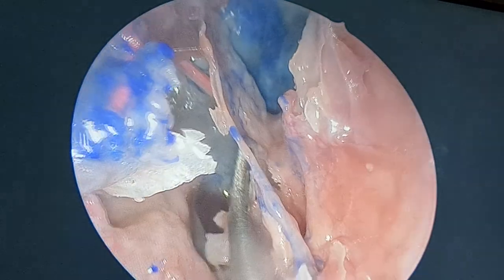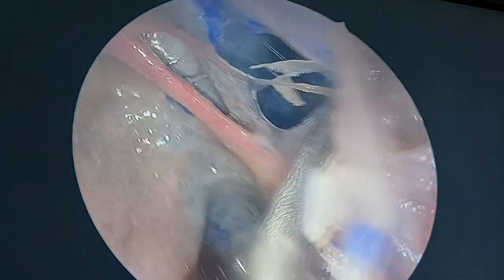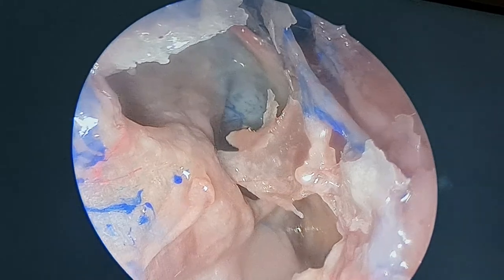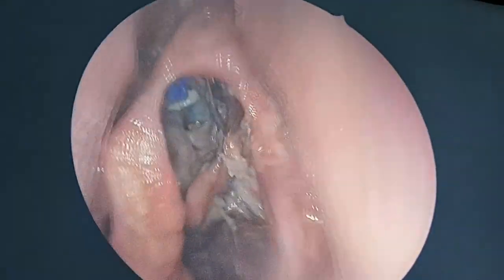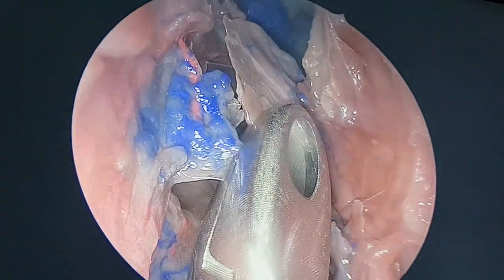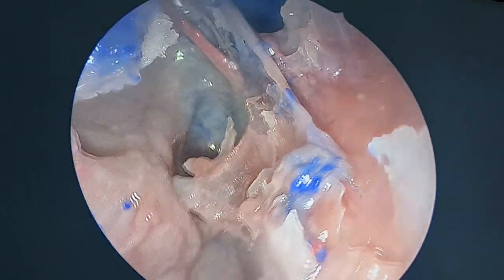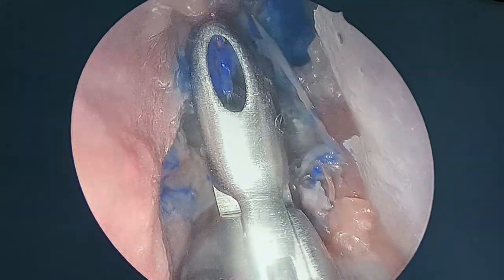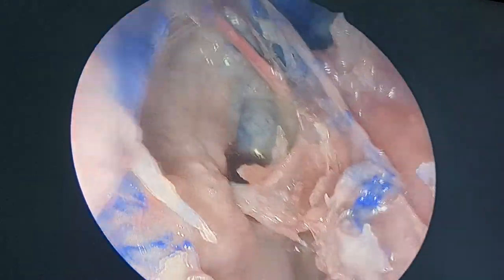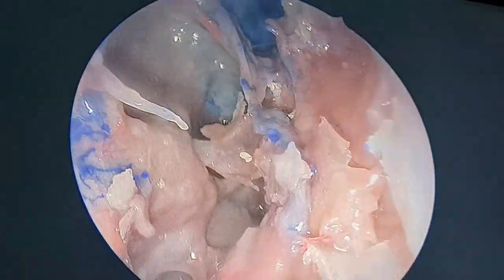This is going anterior, covering the anterior ethmoidal artery. Can you see here? Yes, and see the anterior ethmoidal artery behind. The beautiful injected cadaver. What a beauty. See this? This is the lamella, the upper lamella of the bulla, which I will do. See this? And see the anterior ethmoidal artery. The moment you remove the bulla, then you can. So, generally, this is not a very safe one. As long as the bulla is intact, it mostly reaches the skull base. As long as it is intact, you don't need to bother about the anterior ethmoidal artery. And see, the artery is so well protected.